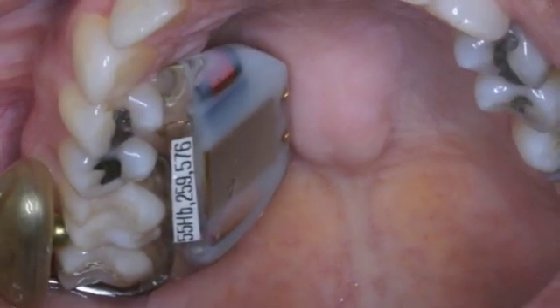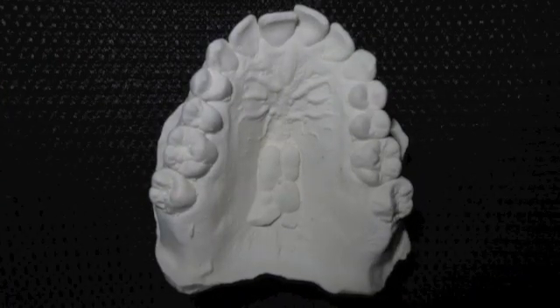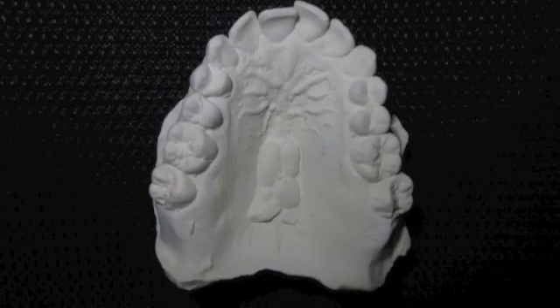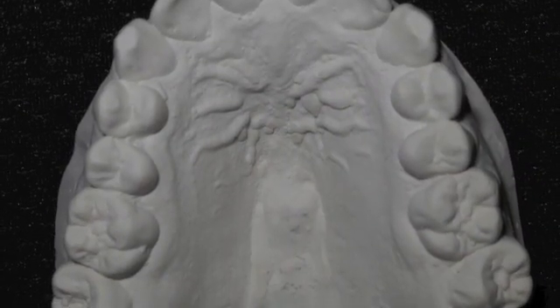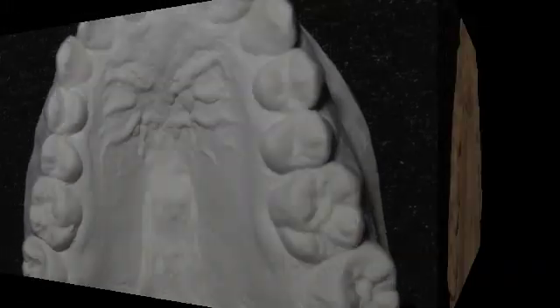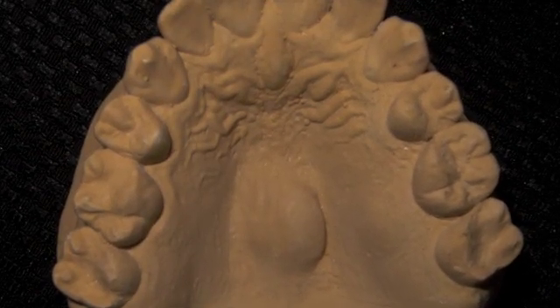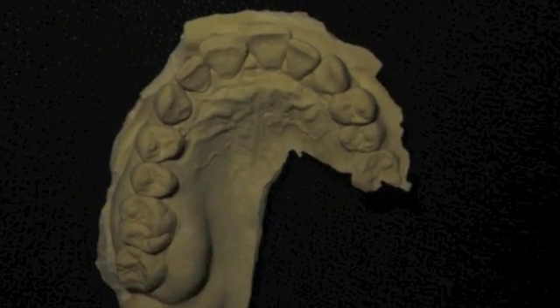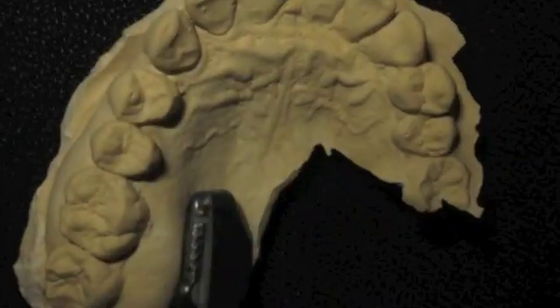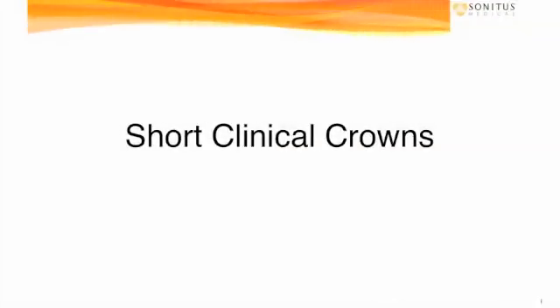And here's an ITM butted up against a tori. So one solution on this particular patient is that they had their tori removed. Removing a tori is a good solution for some patients, but maybe not all. And on some patients, we're simply not going to be able to put the battery up on the roof of the mouth. Here's a patient with a very large exostosis, and you can see what effect that might have on the battery. Now, we may be able to work around it, and we may not. So tori and exostosis can be a problem.